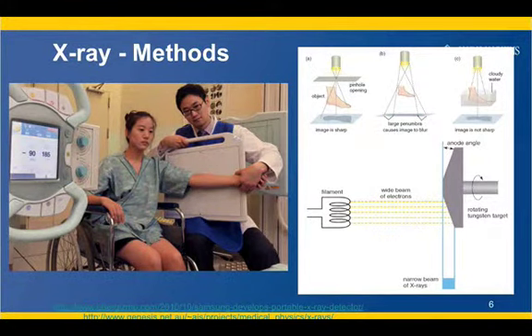The methodology of the X-ray is as follows. A patient is placed in front of the X-ray detector and pulsed with X-ray beams. The image densities are based on absorption by structures of various densities in the body, from air, which is the least dense and black, to bone, which is the most dense naturally occurring and white substance in the body. Metal or artifact are non-natural substances that are denser than bone and appear the brightest white on an X-ray.